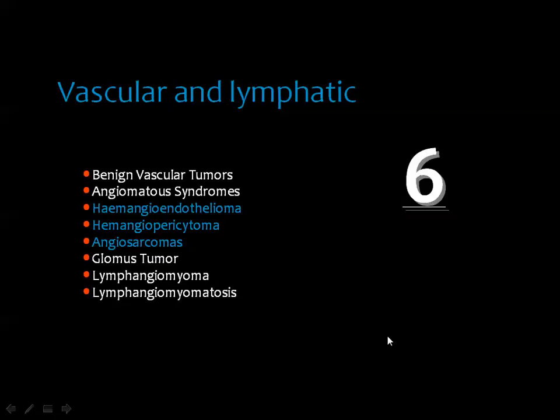Finally, we come to the vascular and lymphatic lesions, and we will start first with the arterial aspect, then we go to the lymphatic aspect.